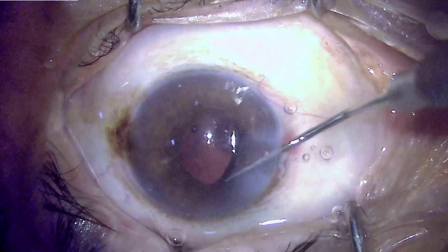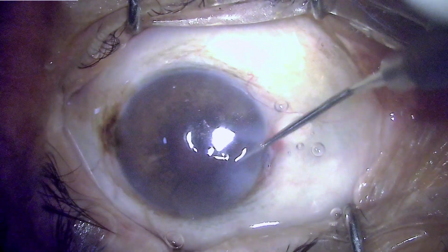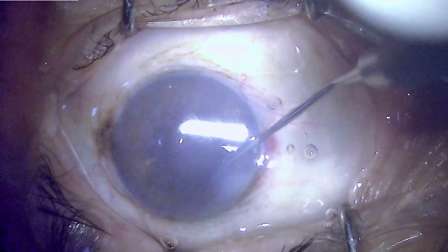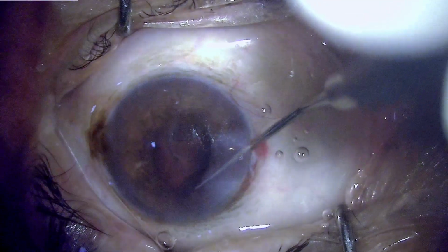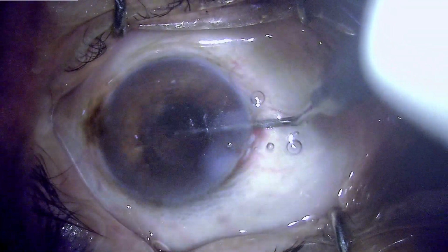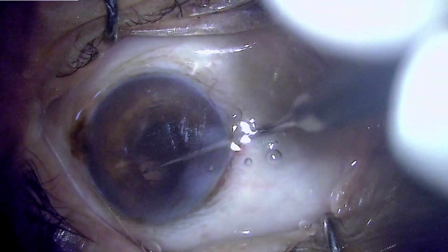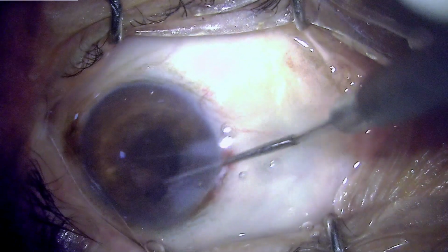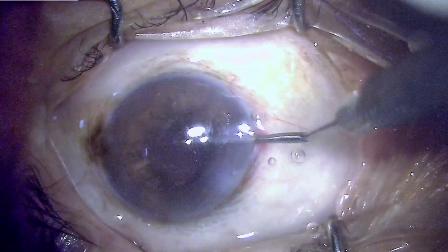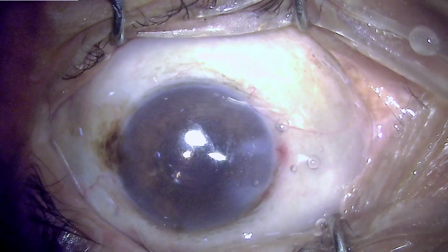Small pupils, so small that we can see that the IOL is being captured into the pupil size. One has to really push the IOL back into the posterior chamber and then dilate so that the edge of the iris can be overcome when it is opposing the movement of the IOL to be dialed.